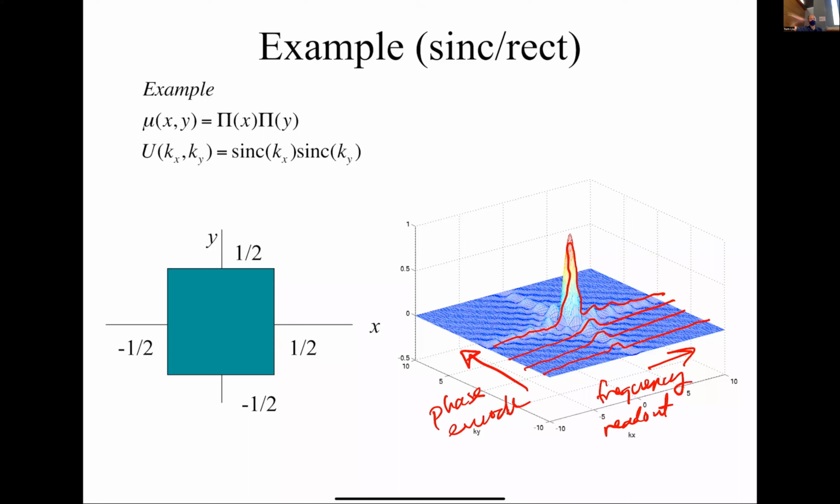So there's typically a fast direction where we zoom across, and a slower direction where we step by step. Just by convention, this is Kx and this is Ky. That's just the convention we have in MRI. In 3D imaging, you could also add Z, and so you could do phase encoding in Z as well.